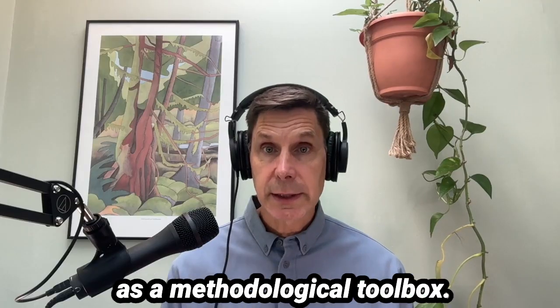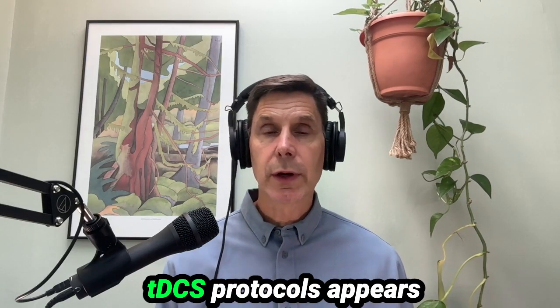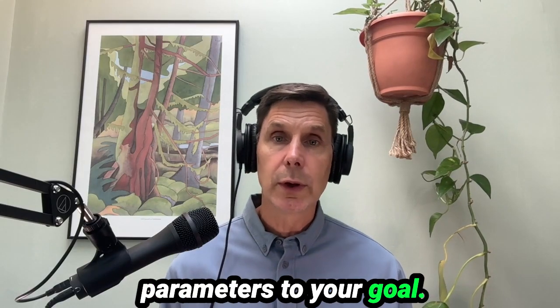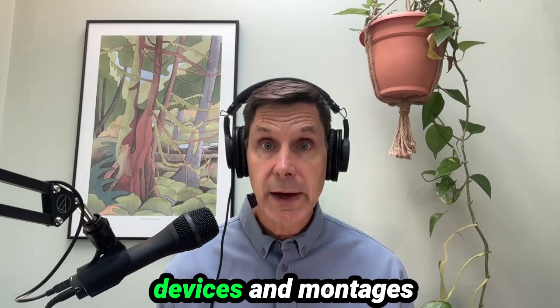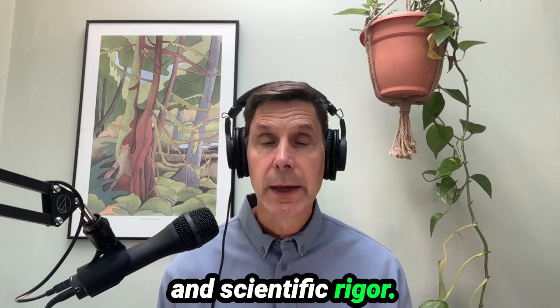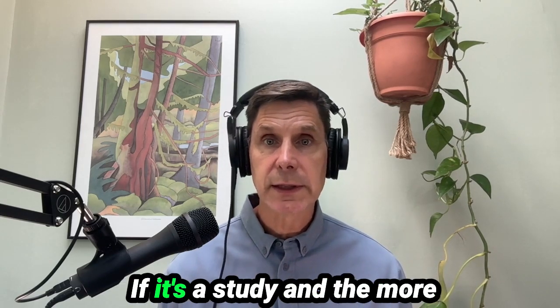So some final thoughts. It's important to look at this as a methodological toolbox. Designing effective tDCS protocols appears to be a combination of art and science. You need to match your stimulation parameters to your goal. You need to consider the population that you're treating. You need to choose devices and montages or electrode placements that are based on feasibility and scientific rigor. You need to test and refine through careful measurement and reporting if it's a study.